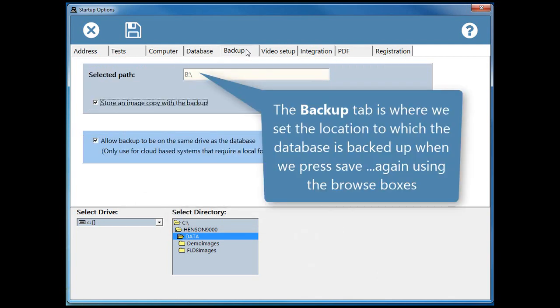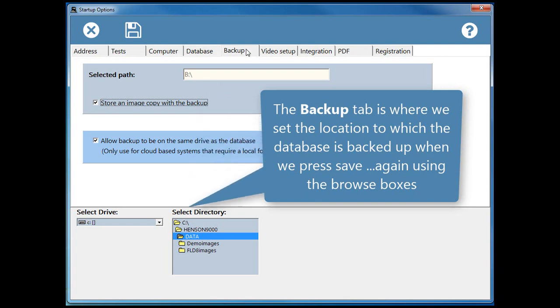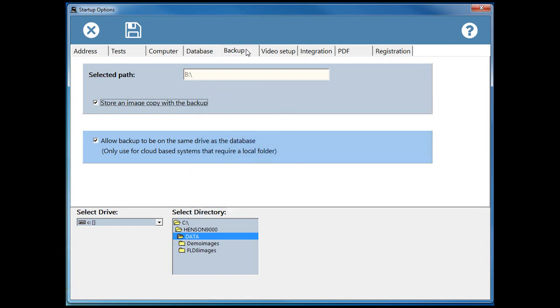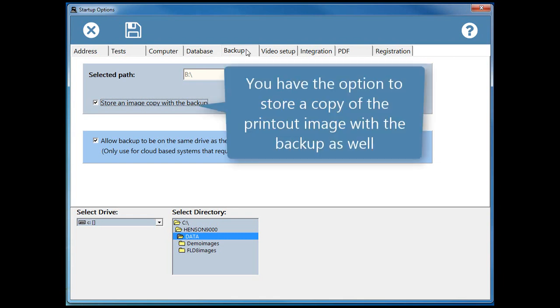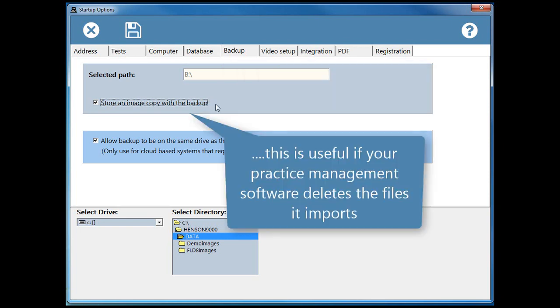The backup tab is where we set the location to which the database is backed up when we press save, again using the browse boxes. You have the option to store a copy of the printout image with the backup as well. This is useful if your practice management software deletes the files it imports.